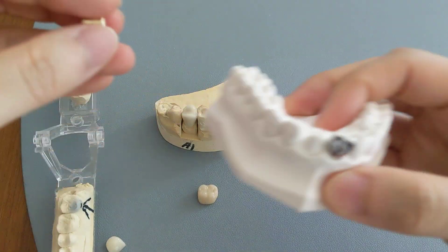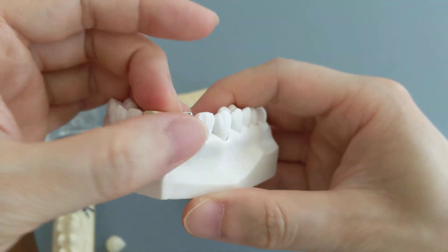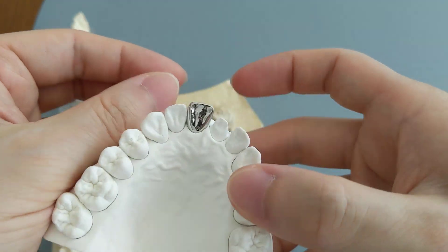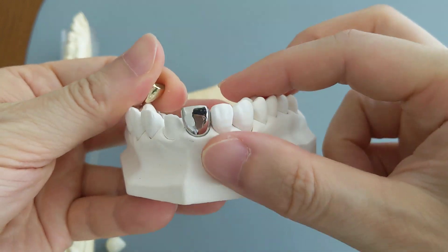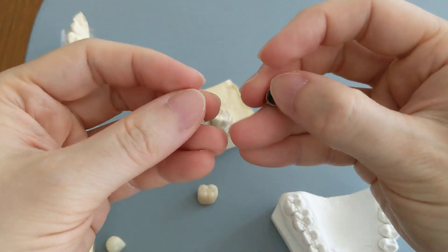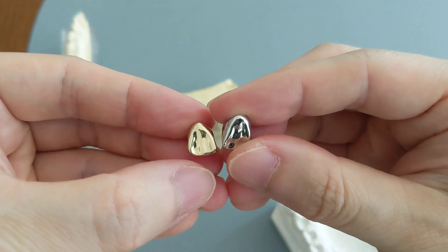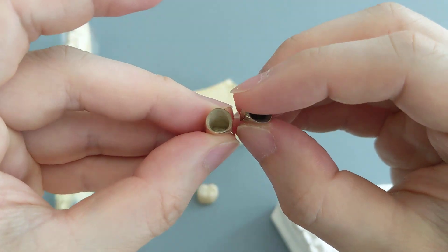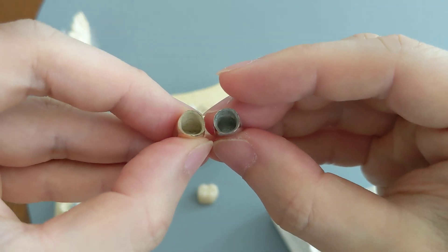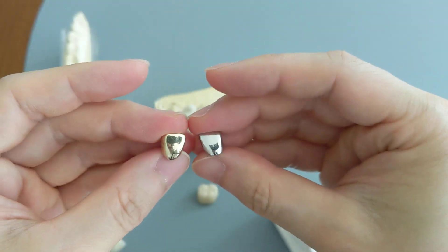You can compare that to the metal one here. They're virtually identical in shape — they're just made of different materials. Technically the gold and the metal are both considered metal crowns, it's just that the gold one is made of precious metal — precious yellow gold. We do give it its own distinct category because of that.